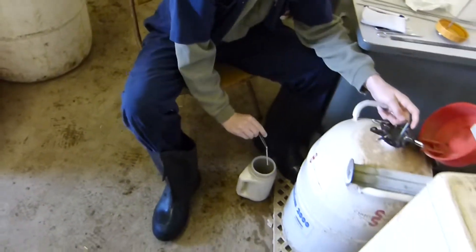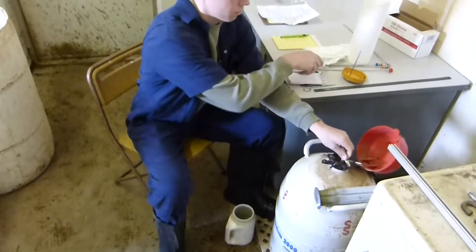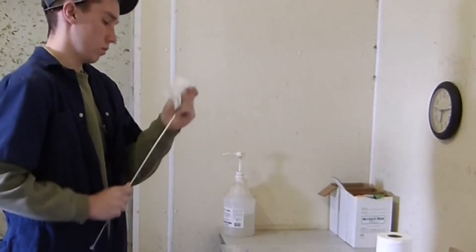Once I find the semen I put it into the thermos of water and let it thaw for about 45 seconds to a minute. I prep the gun by taking a paper towel and warming the end of the gun where the semen straw will go.